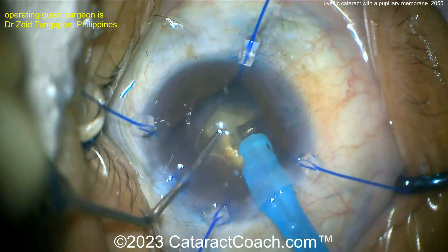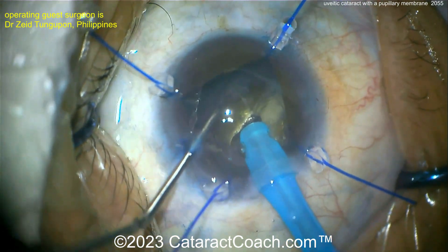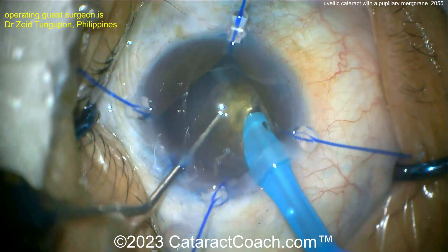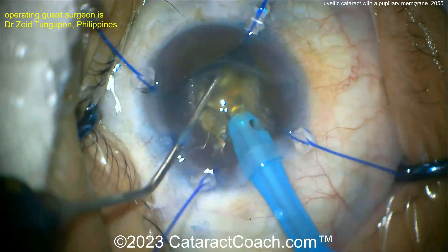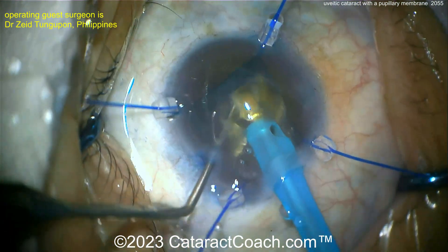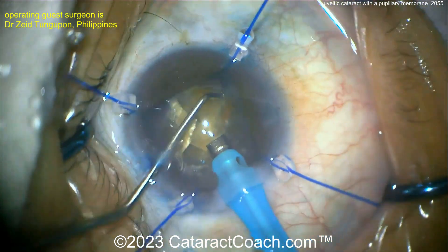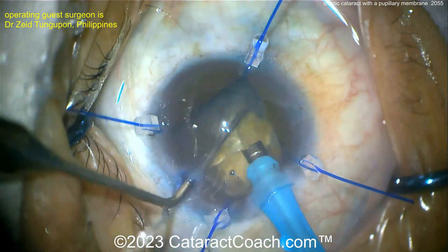Here's a chop technique. Good density — the chop didn't go all the way through, which is typical with these dense cataracts and that leathery posterior plate. Another chop — it didn't quite separate. Another chop — very nice technique. I like iris hooks; they give you a little more flexibility than just a pupil expansion ring and provide good access.